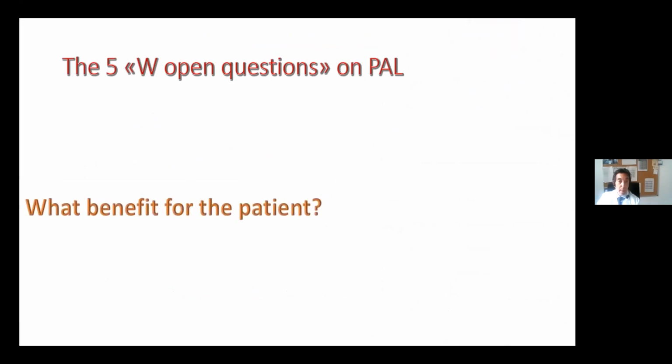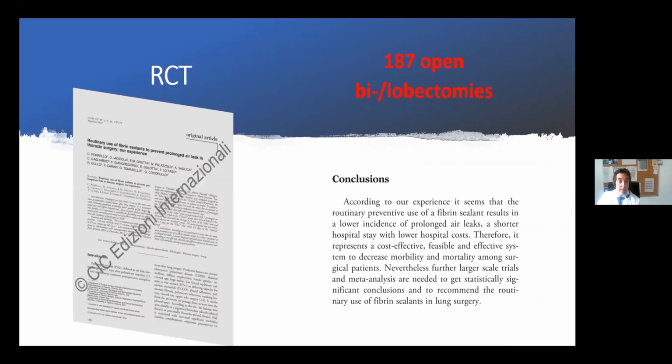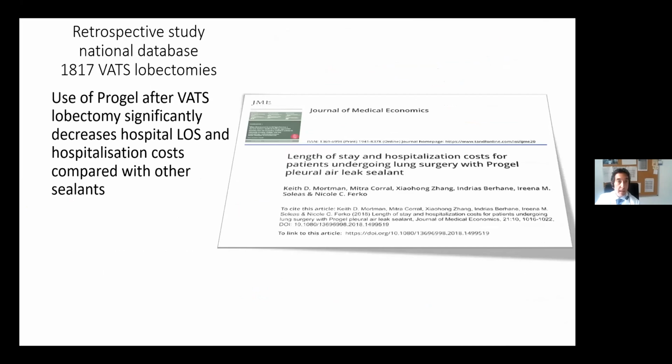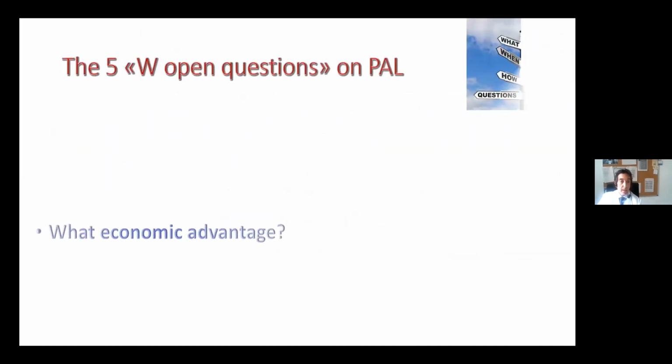Benefit of this treatment. We have a recent randomized controlled trial, an Italian one, but after open lobectomy, and a prospective and a retrospective study analyzing the Progel sealant, with the conclusion that it significantly decreases hospital length of stay and hospitalization cost.